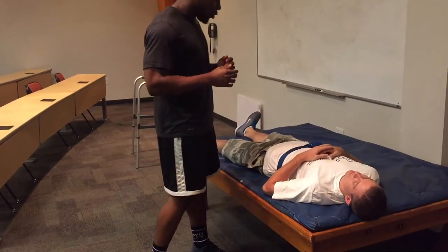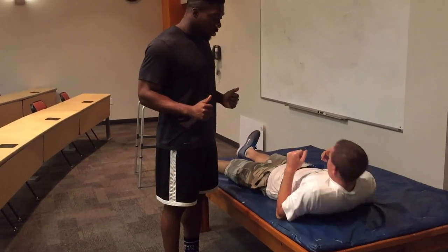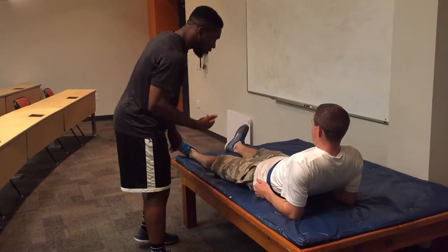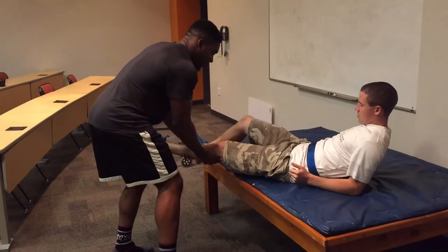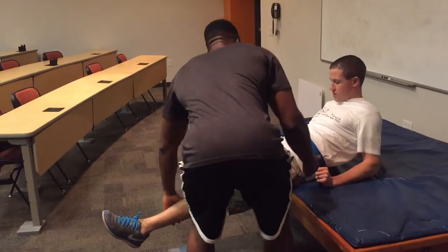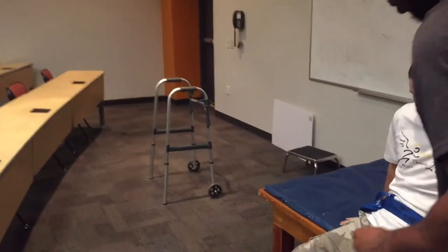Okay. So what we're going to do, we're going to have you sit up first. You're going to go ahead and sit up on your elbows here, as you can. Yep. And I'm going to help bring your left leg off of the table, and then you can go ahead and swing your right leg off also. Okay. And as you do that, you can go ahead and scoot to the edge of the bed. There you go. Scoot up slightly. And then get those on here. So what we're going to do, I'm going to go ahead and bring the walker here.